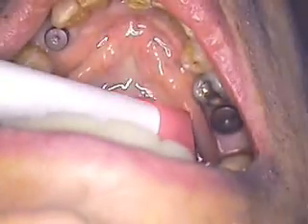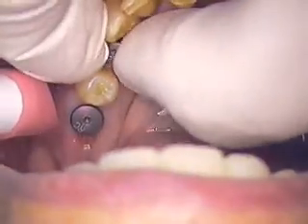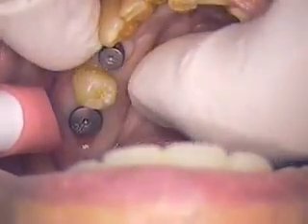Here we are back in Ken's mouth. I'm going to move right to the first bicuspid and go ahead and remove the healing abutments. All three healing abutments are Straumann bone level RC flared healing abutments.